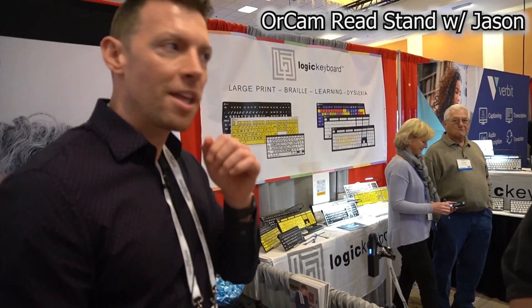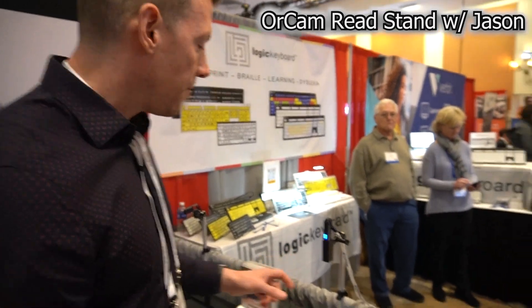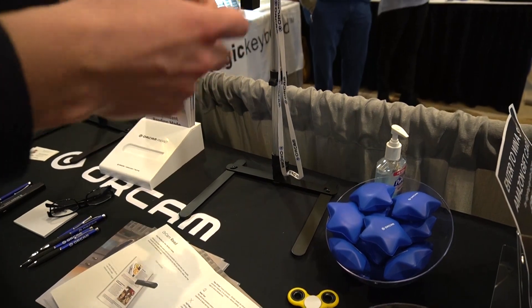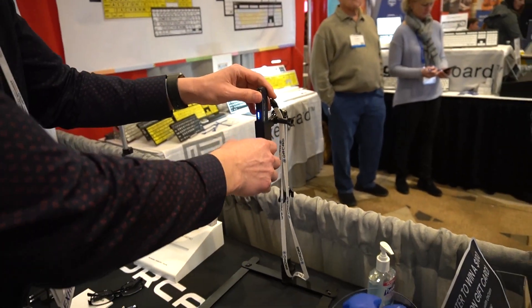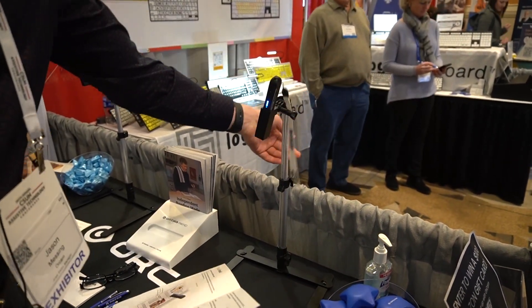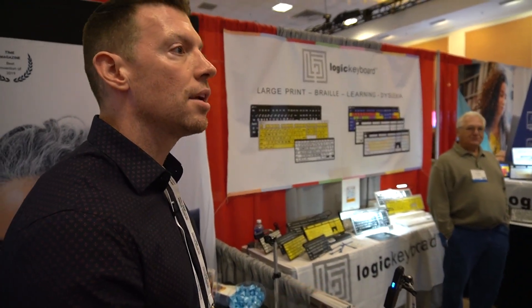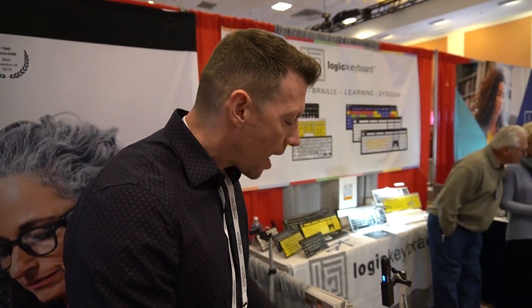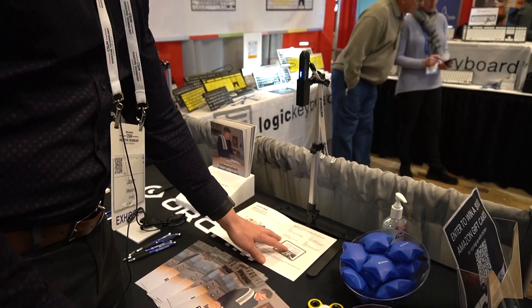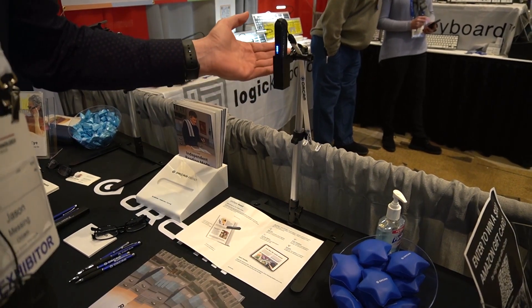Absolutely, so thank you for stopping by the booth. I'm happy to talk to you guys. So the stand for the Reed device comes in two separate parts that you will put together. If you need something stationary — let's say you have a hard time holding the Reed device to take a picture of the text — you can use the stand, line your document up underneath, and then just press the trigger button and it takes a picture and starts reading.